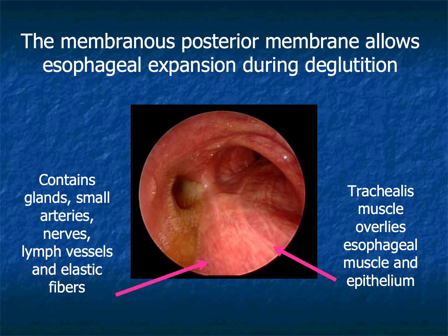It must remain sufficiently stable to maintain airflow, yet flexible enough to accommodate respiration, swallowing, coughing, and changes in intrathoracic pressure. Bronchoscopy reveals these physiological principles directly through movement and anatomy.